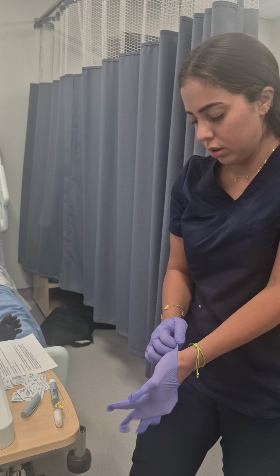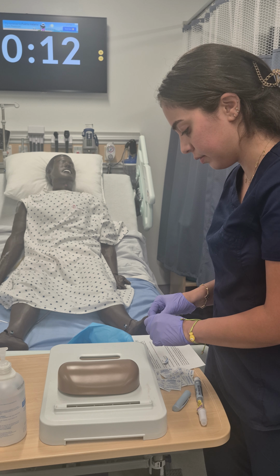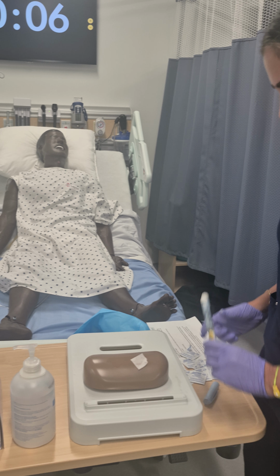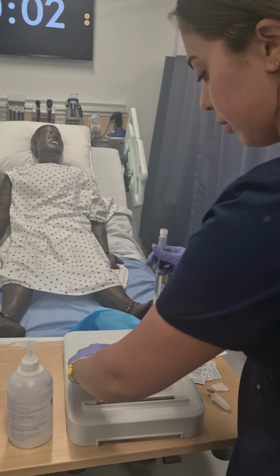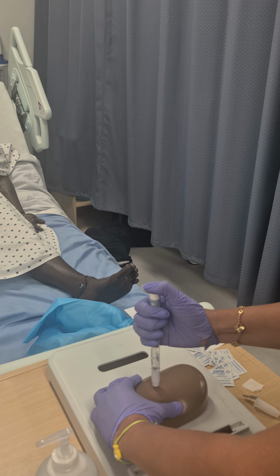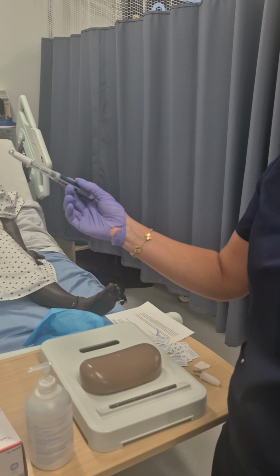Subcutaneous injection. I'm going to be cleaning the site. 15 seconds. Okay. 10 units. I'm going to be pinching. Inject. Hold for 10 seconds. Remove. And then dispose of the needle into the sharps bin.